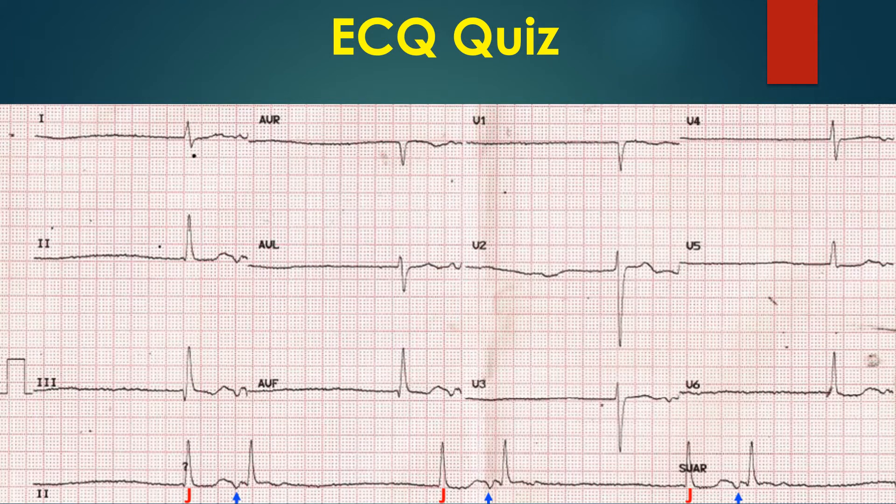The beats marked as J are junctional escape beats occurring at a slow rate. They are followed by inverted P-waves in inferior leads prior to the next QRS complex, marked by blue upward arrows. These beats could be either beats originating from the low atrium, i.e., coronary sinus rhythm, or from the high junction. Inverted P-waves preceding QRS complexes can be seen in high junctional rhythm, as conduction into the atria is from below upwards, away from the positive electrodes of inferior leads.